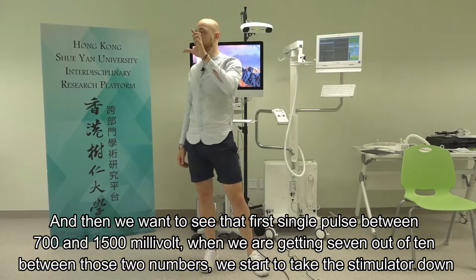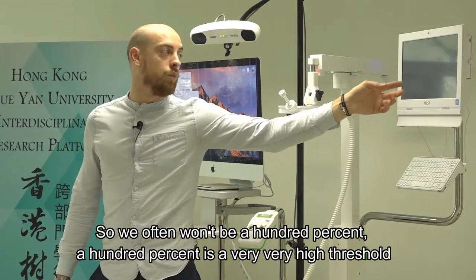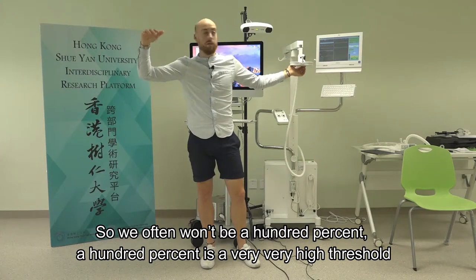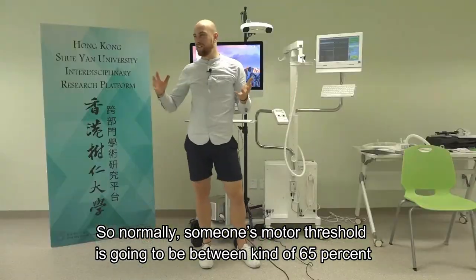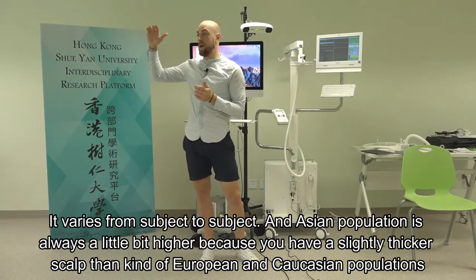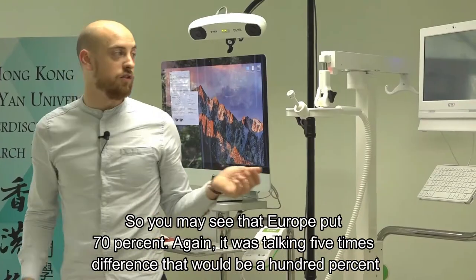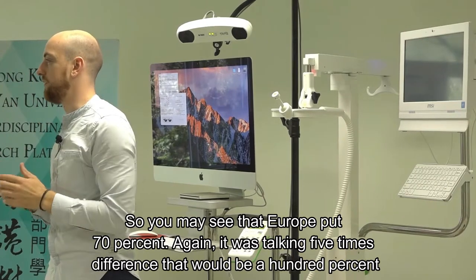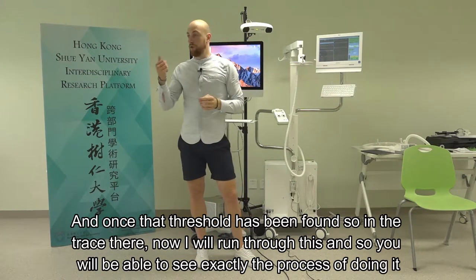When we're getting 7 out of 10 pulses between those two numbers, we start to take the stimulator down. Someone's motor threshold is typically between 60 to 65% of the machine's maximum, though it varies from subject to subject. Asian populations tend to be a little higher - perhaps up at 70% - because of a slightly thicker skull compared to European and Caucasian populations.